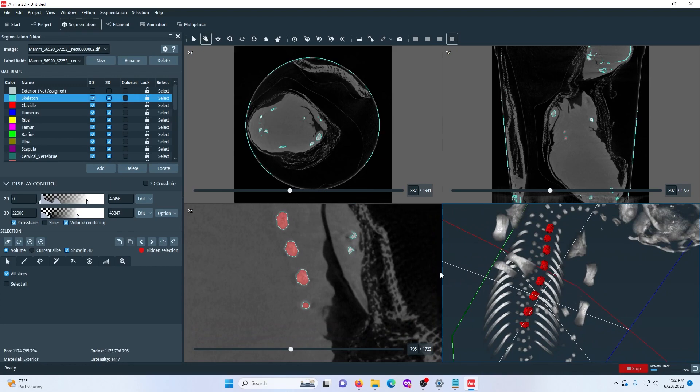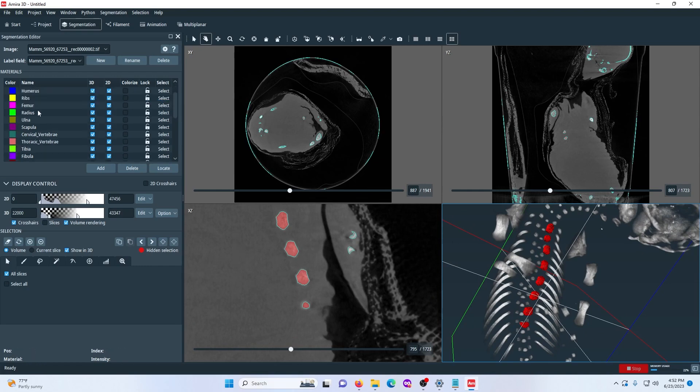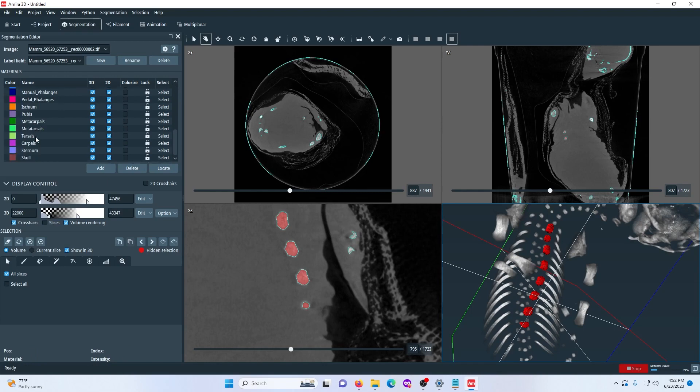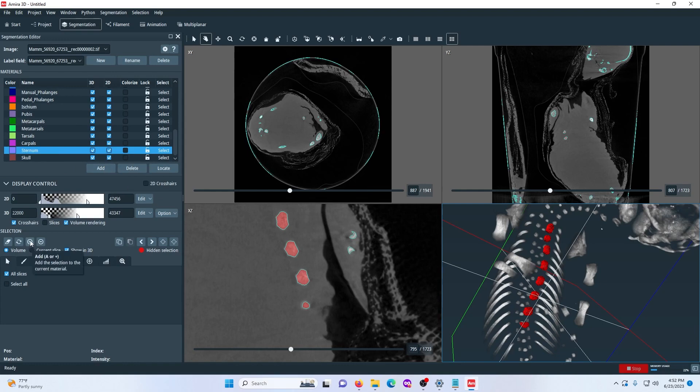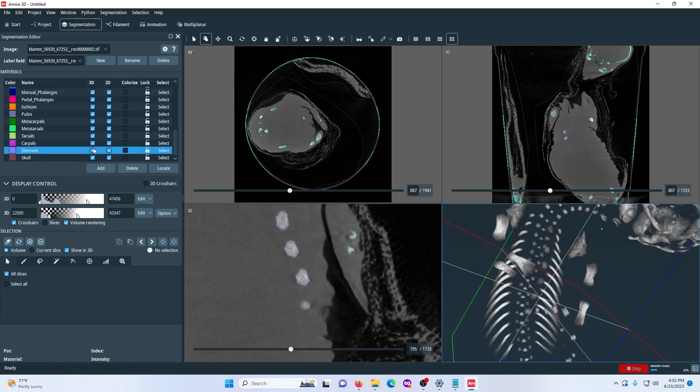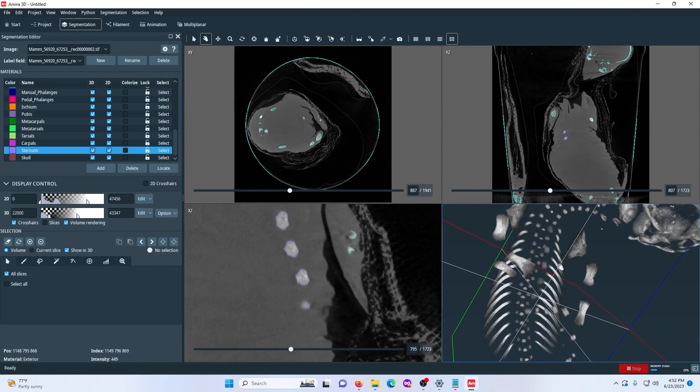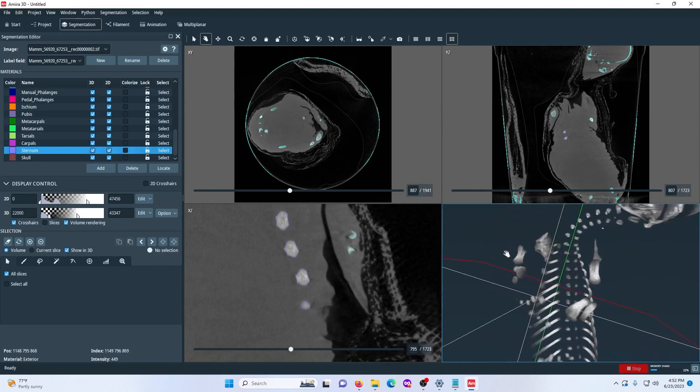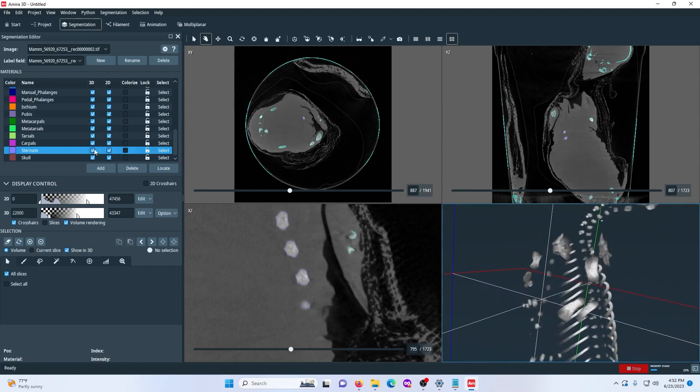So here in order to select this material, in addition to the material I've already selected, I press shift and click. So now that I've selected everything in the sternum that I want to select, I'm going to, oh, and by the way, now that I've selected everything in the sternum that I've wanted to, I'm going to go to the sternum material. Let's see where that is. It's like at the bottom. I'm going to select it and then I'm going to press add. Make sure you do not press the add up here, or else it'll add a new material and it'll just make things messy. You want to click the add down here, the plus sign.